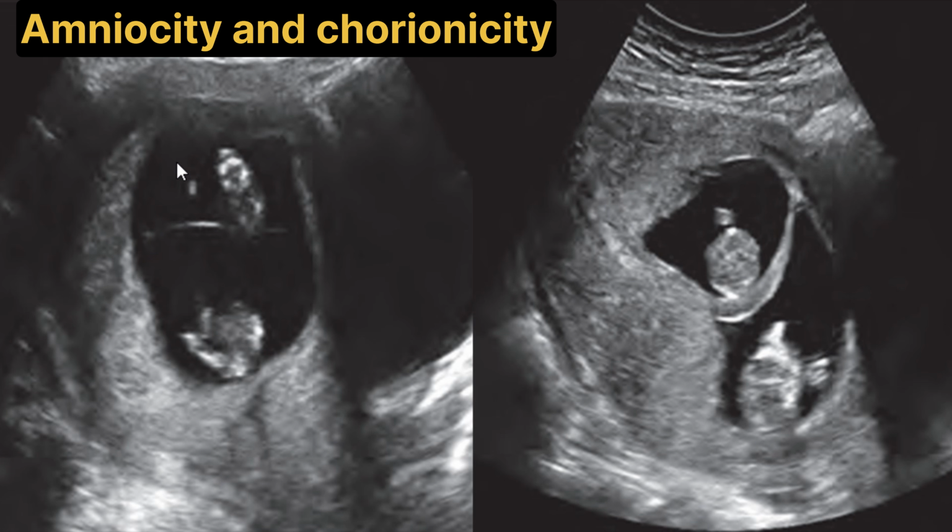This is the longitudinal transabdominal image of the gravid uterus during the first trimester. It shows a twin pregnancy which is separated by the thin echogenic membrane that is consistent with the monochorionic diamniotic twinning. Now in the sonogram, we can see the dichorionic diamniotic twinning.